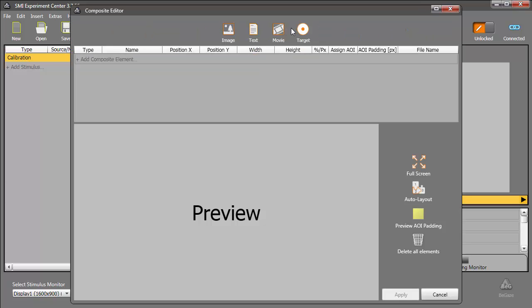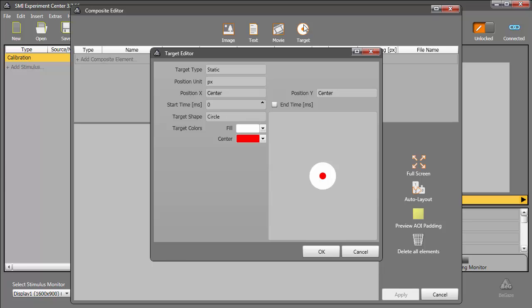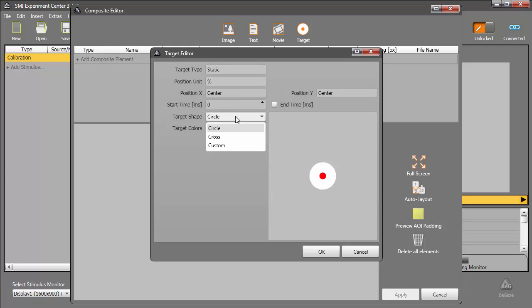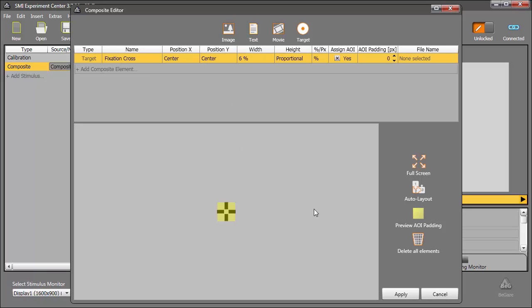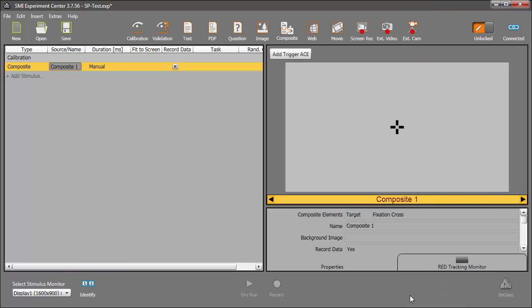Once more, I'll select Target. First, we want to create a static fixation cross. I'll change the position unit to percent, and shape to cross, leaving the rest of the attributes at their defaults. Once I save the composite stimulus, I can give it a name, fixation cross, and set the width, 6% again. I'll click Apply to set our definition.